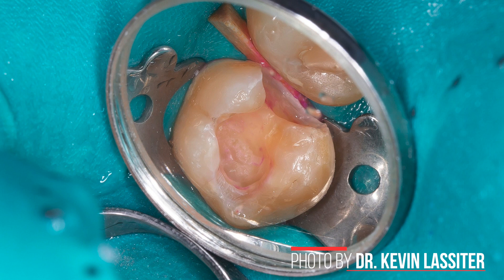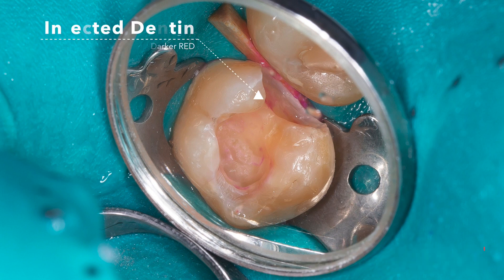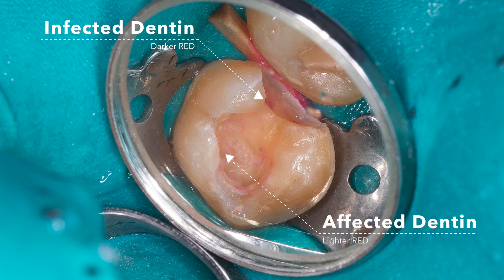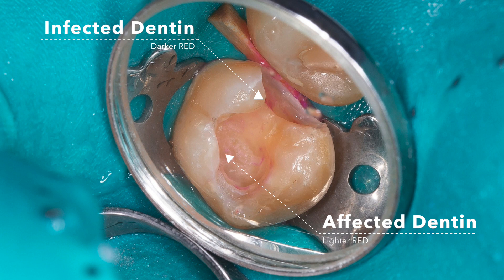The second reason you should consider using a caries detector dye is because it actually stains infected and affected dentin — but the key is understanding how to read this. When you look at the dyed dentin, many papers discuss how caries detector dye stains infected dentin with a darker, deeper stain, whereas affected dentin produces a lighter, less pronounced color. If you can, you really should try to remove all the caries.